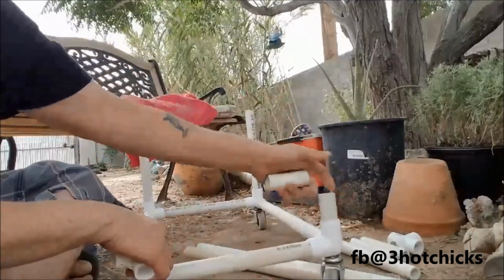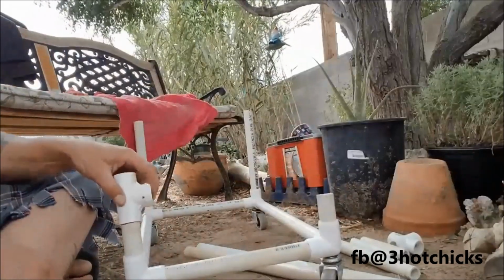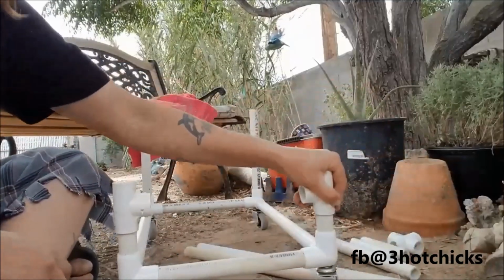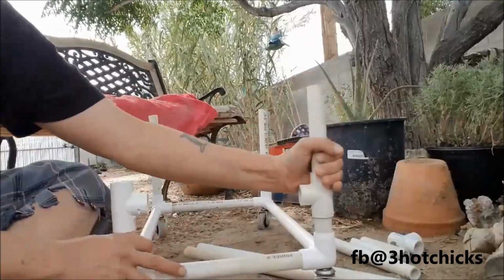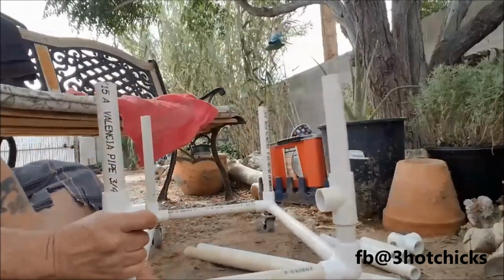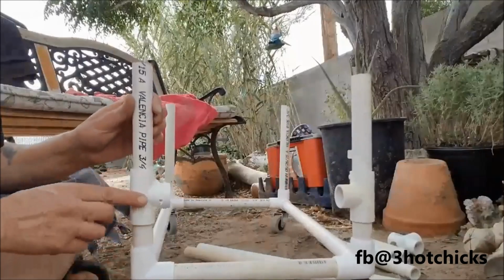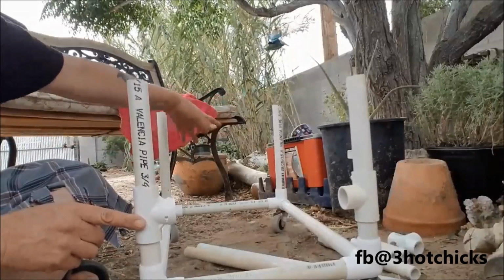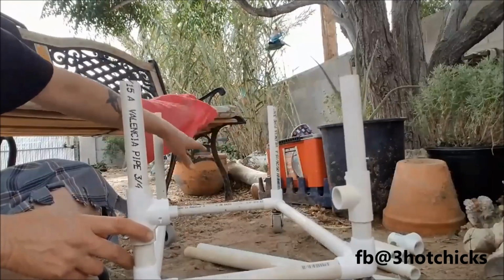So we got a small piece on the bottom, on each side. And then we take our T-fitting, put it in there. And 1 T-fitting here. And then add on the rest of the height. Now you can do the same thing with the back. Instead of having it all 1 length, you can cut it and put the T-fitting in, and then that way when they sit in the sling, depending on how big your chicken is or how they sit in it, their tail doesn't get caught up in the bar.